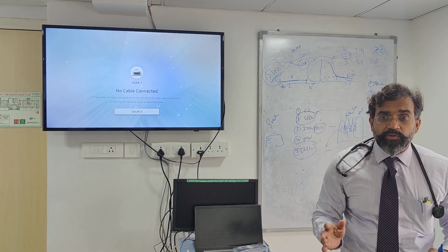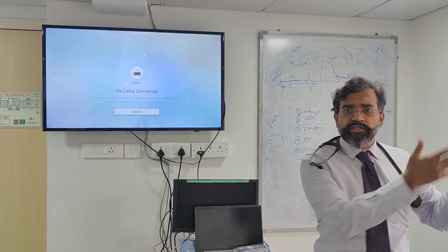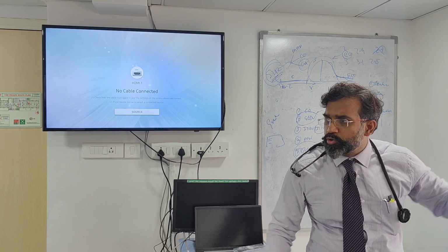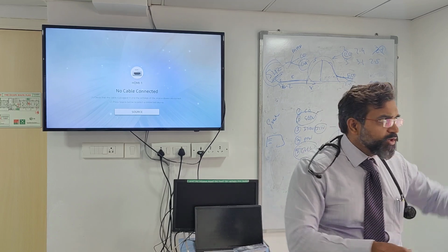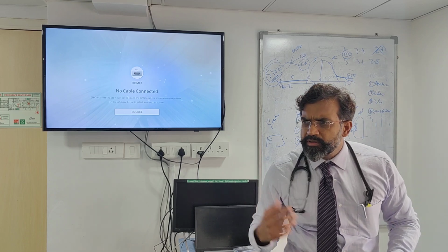So, a patient who has come in with intractable diarrhea and has had full diarrhea in the night. Yesterday the GEDV was 700. Today it has become 200. Clearly you can think, it was 700 yesterday and now it is 200. So there is a definite change in the GEDV, and that definite change corresponding to that history gives me the indication that maybe I should give him fluid.